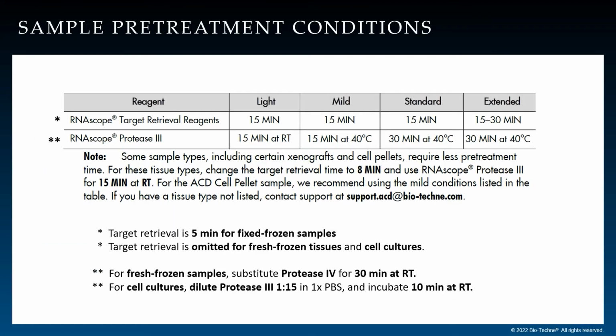As I mentioned, the pretreatment incubation conditions are tissue and sample specific. Most tissues require the standard pretreatment conditions. However, you should also consult the table in Appendix A of the miRNAscope user manual to find conditions for your tissue type. This table lists the incubation conditions for target retrieval in FFPE sections and conditions for protease treatment. The recommended target retrieval time for fixed frozen samples is 5 minutes, and cell cultures require treatment with dilute protease 3.